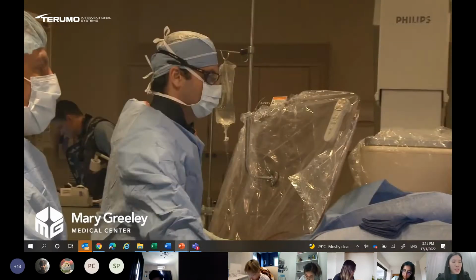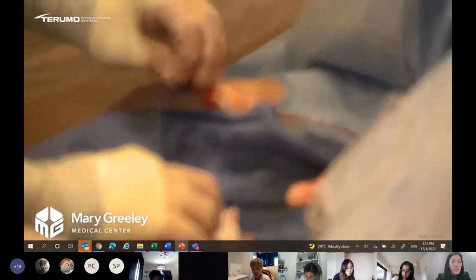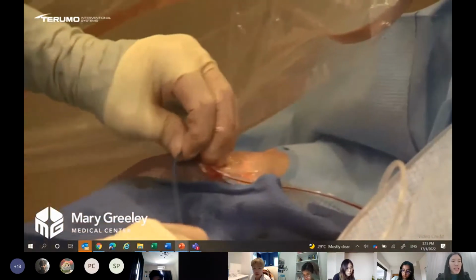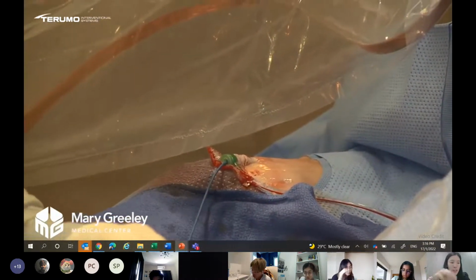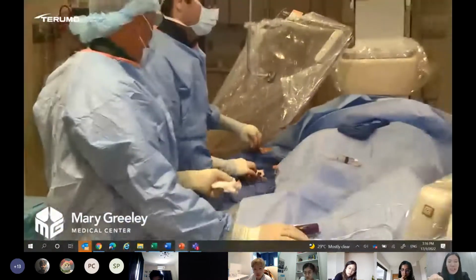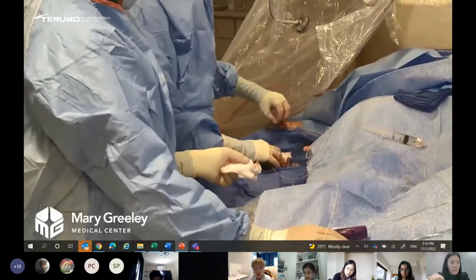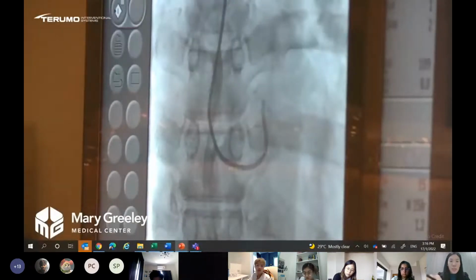So now the operator will try to rotate the diagnostic catheter. So he's rotating, right, to try and engage, or to put the tip at the coronary opening. He will rotate at the proximal end, and then the distal tip will turn. If he thinks that this tip is at the correct position at the opening, he will then prepare to check using the contrast media.